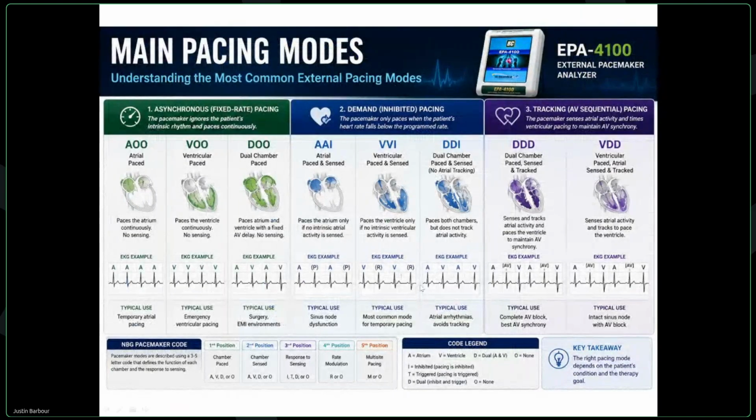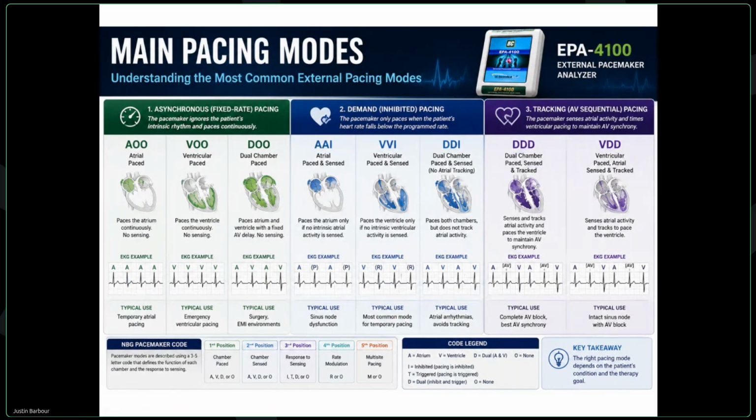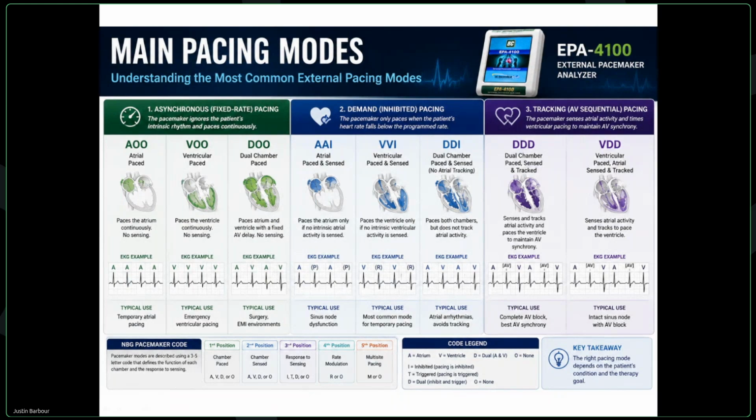So with all that being said, here are some of the main pacing modes that will be abbreviated, and I'll show you how to activate those on the external pacemaker. It's not very difficult to go in and select the different modes. It's kind of complex to try and understand what the mode is looking for.